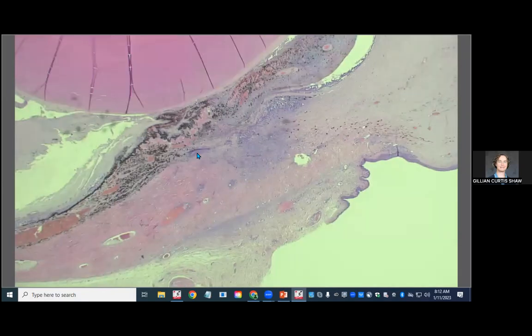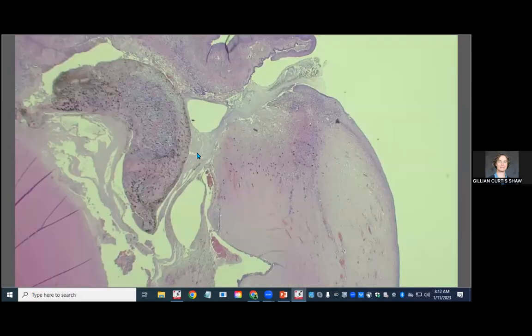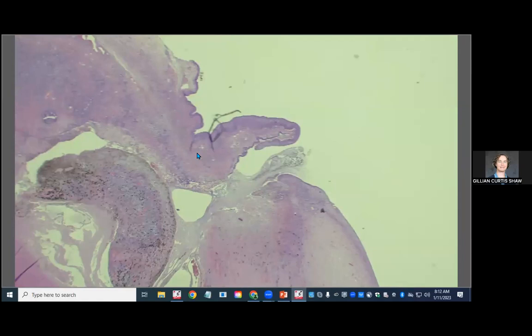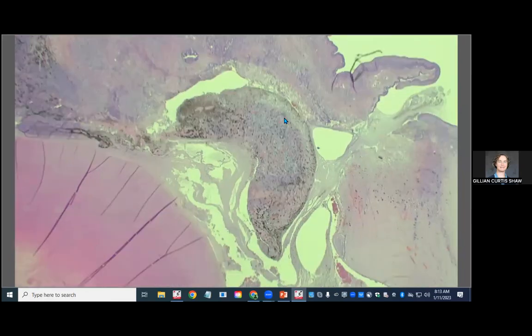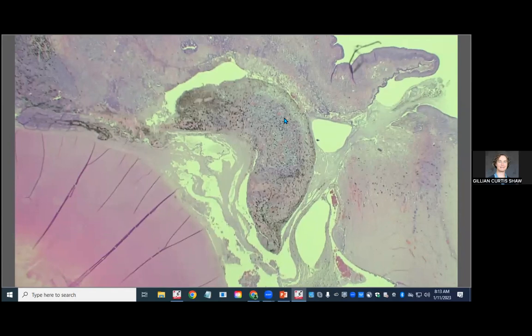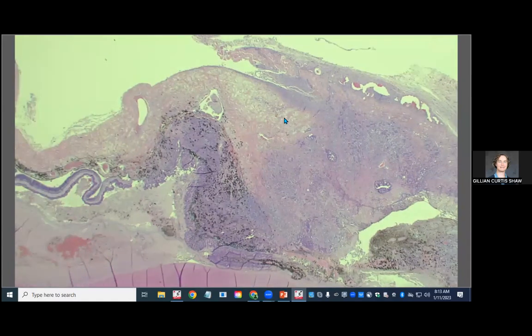So here is our increasingly cellular iris leaflet. And on the other side, here's our big hole. And it is definitely full thickness. There is some kind of proteinaceous exudate that's squeezing its way out of the globe into the world at large. The iris is definitely more purple than we want to see. And then we have all of the cellularity out in the limbus. So we're going to go ahead and go closer and admire it.